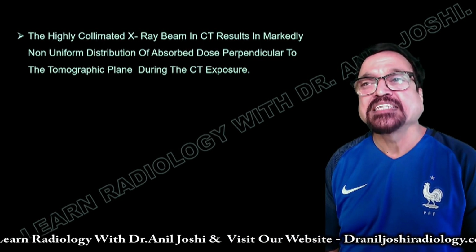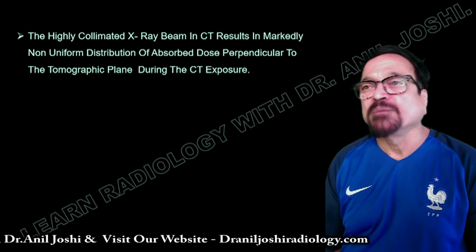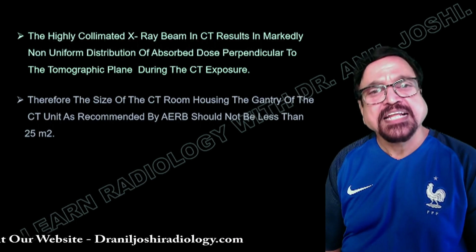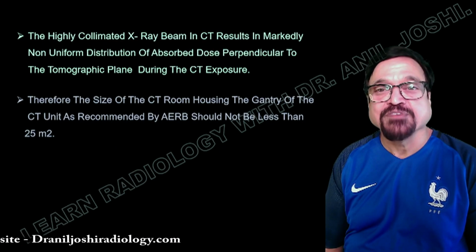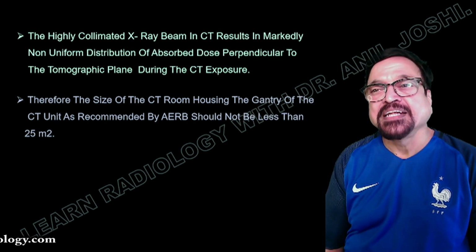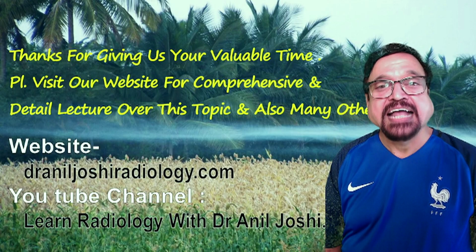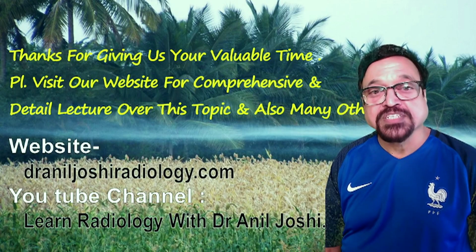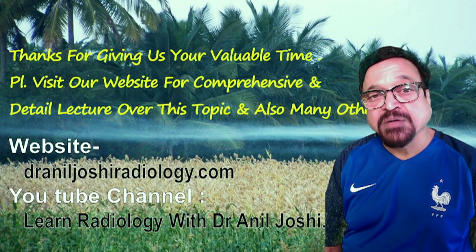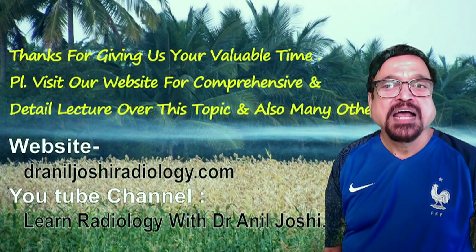The highly collimated X-ray beam in the CT results in a markedly non-uniform distribution of absorbed dose perpendicular to the tomographic plane during the CT exposure. So they are considered much safer than what we think. They are fairly safe units. Therefore, the size of the CT room housing the gantry of the CT is recommended by AERB to be not less than 25 meters square. As a radiographer, as a radiologist, not only do you have to take care of yourself and of the patient, but you have to take care of the patients' relatives and also surrounding neighboring people. For that reason, a CT room has to be designed properly.